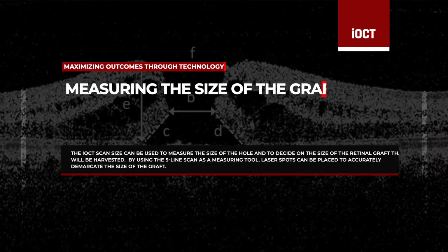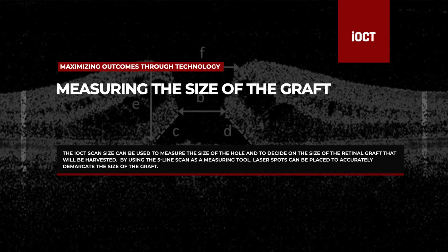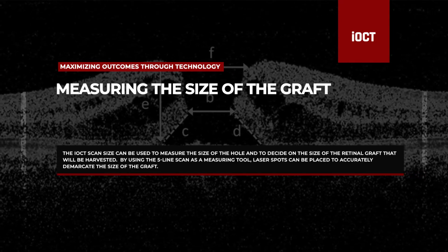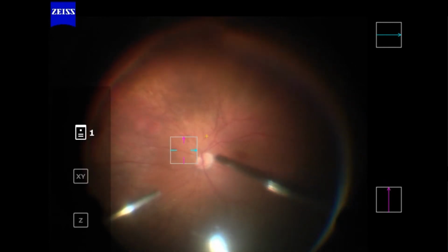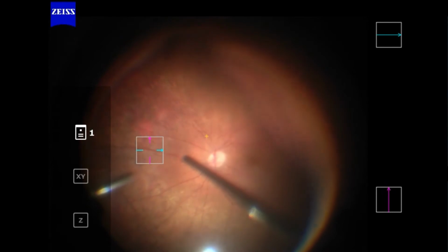The IOCT scan size can be used to measure the size of the hole and to decide on the size of the retinal graft that will be harvested. By using the 5-line scan as a measuring tool, laser spots can be placed to accurately demarcate the size of the graft. The scanning reticle is first positioned over the macular hole and then displaced to the harvesting location.